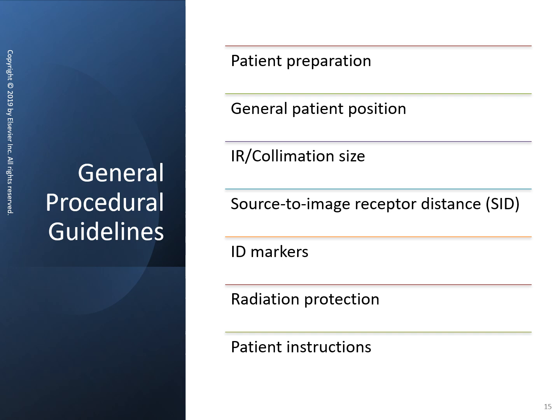Generally, your patient, if they can tolerate it, will do all these exams upright. It's just easier on the patient, unless they've been in a motor vehicle accident and they're not able to stand. You're going to get a better examination with them upright. The other consideration is, is your patient strong enough, your geriatric population? Can they stand up for an extended period of time? That would be another consideration to do them supine. It's perfectly acceptable to do a rib or sternum series supine or prone as the case may be, rather than upright, but the lion's share of your clinical practice you're going to be doing these exams upright.